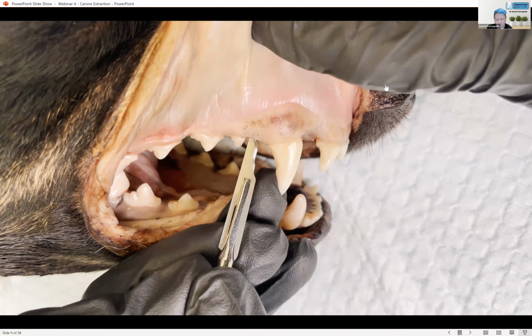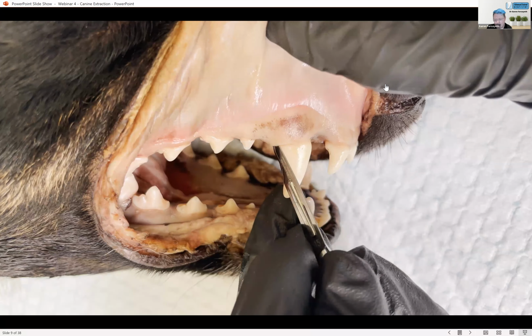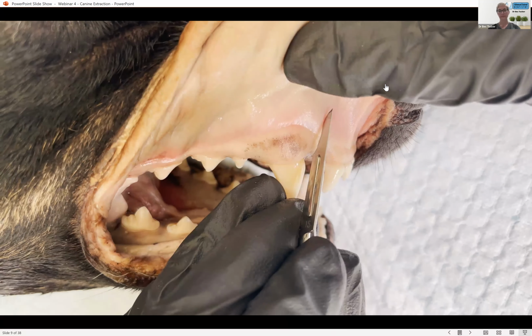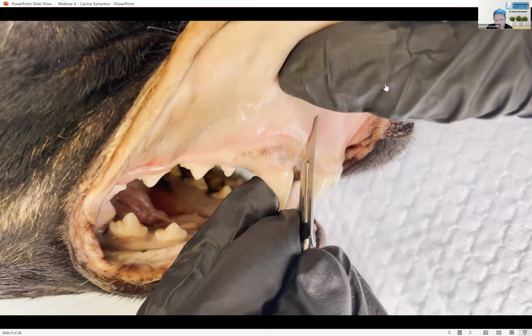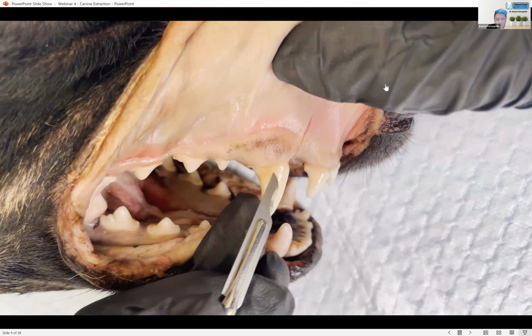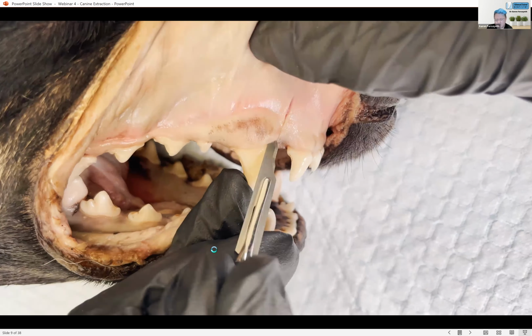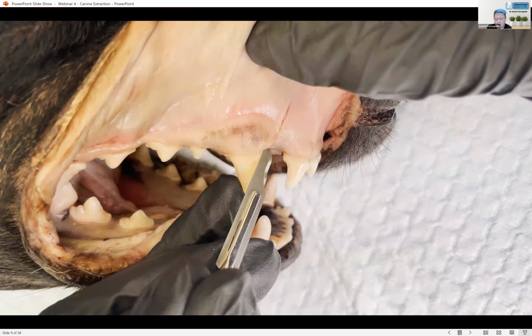So here's that distal incision between premolar 1 and the canine there, and the vertical mesial incision. For some animals, all animals, be careful of it, but certainly in our smaller patients, not so much the brachycephalics, but certainly they are in that group as well, just watch the dorsal point of that incision there. That can actually plunge into the nostril, and then actually into the nasal cavity. You'll go over the edge of the nostril there. It's unusual to do that, but it is there. That's one thing to be on the lookout for.